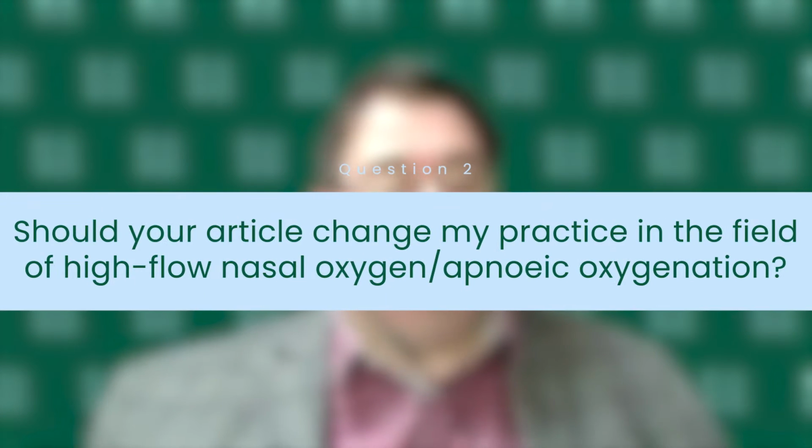And I suppose I should correct myself from my inadvertent use of acronyms. In the article itself, we talk about high flow nasal oxygen, HFNO SV, and HFNO AP. So high flow nasal oxygen spontaneously ventilating and high flow nasal oxygen apneic. They're different techniques for different times. But our desire to write an article just now is really about delivering patient safety and improving patient safety around high flow nasal oxygen techniques now that it's being more widely adopted. It may not change your practice, but we'd very much hope that using the questions we've provided, it will help you just make sure your practice is as safe as it possibly can be.